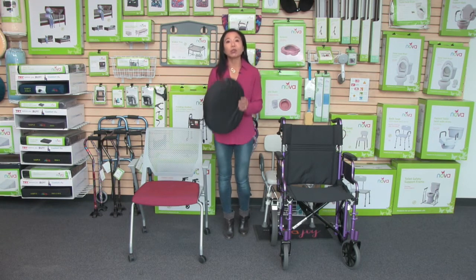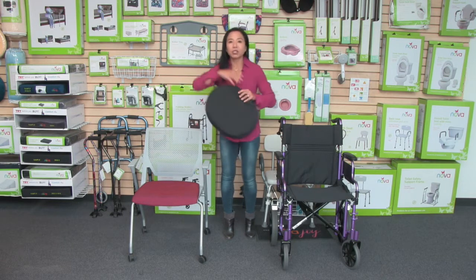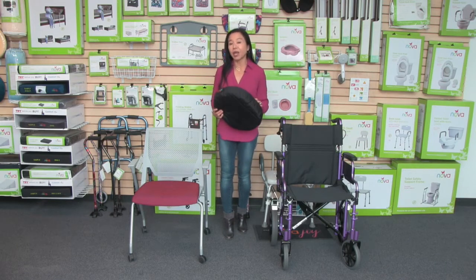We put a full cover around it so it looks like an everyday cushion and it's more discreet. The top of the cushion has that egg crate design and that helps with breathability and also air circulation.